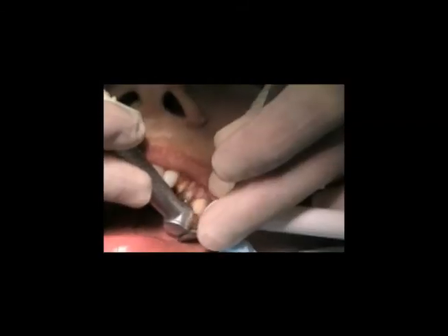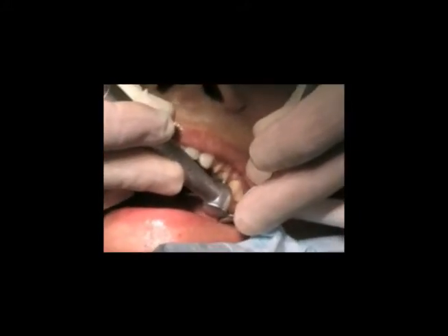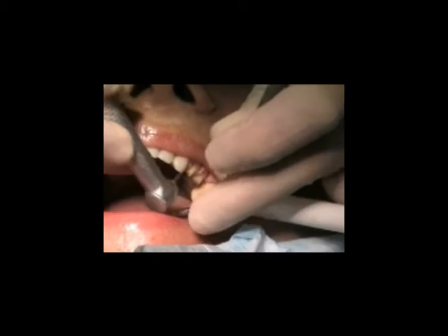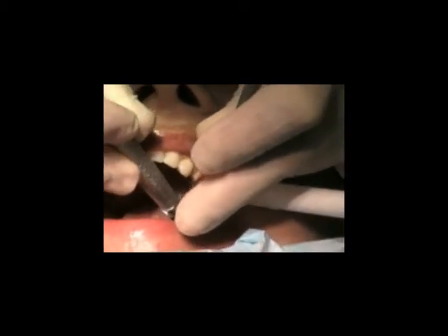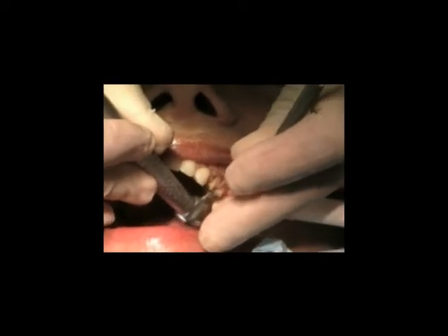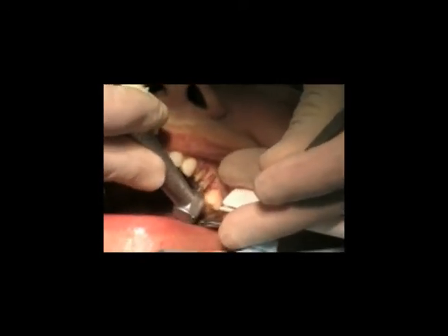The other thing that we're doing is closed sulcus crown lengthening. This is done with the Erbium Chromium laser — one particular brand, the BioLase water laser. With the Erbium Chromium laser it cuts both hard and soft tissue.